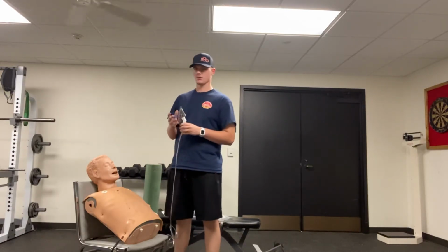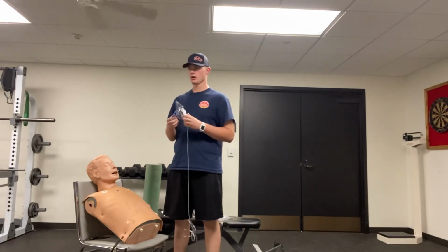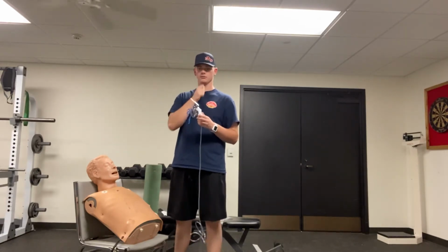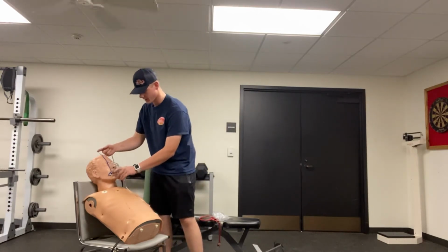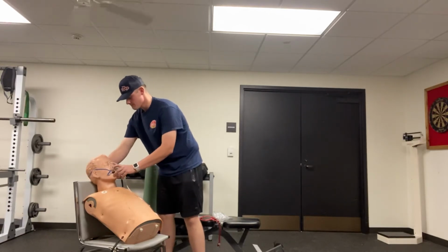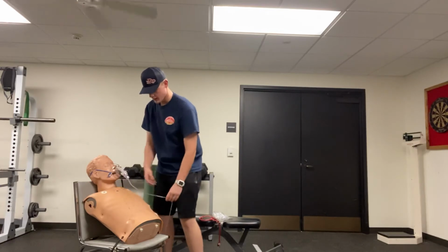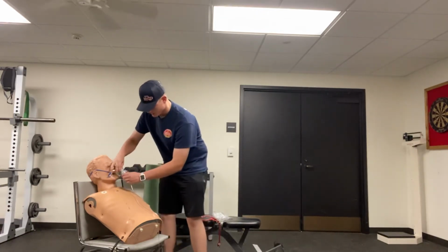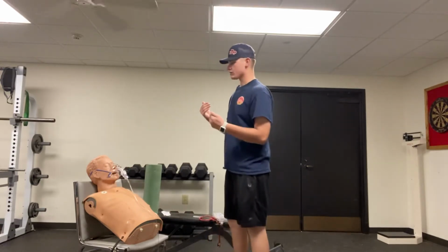Once it is starting to aerosolize, I'm going to place this over the patient's head. If I see that they become uncomfortable or anything of that nature, I can then go to a handheld nebulizer. I'm going to place this over the patient's face, making sure that I do not disrupt the patient in any way. I'll ask the patient, does that feel comfortable? If yes, perfect. Now I'm going to just let the patient breathe.